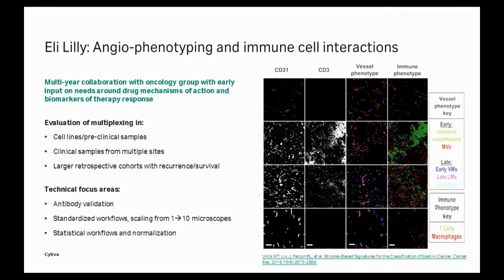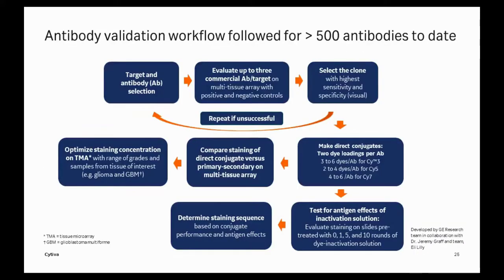And here on the right is just some of the work that we published with Eli Lilly that they were very interested in. Blood vessel development, and we looked at many different markers related to early stage blood vessel maturation, late stage blood vessel maturation, and the interaction with the immunoprofiling.